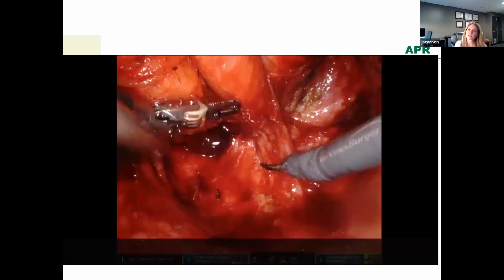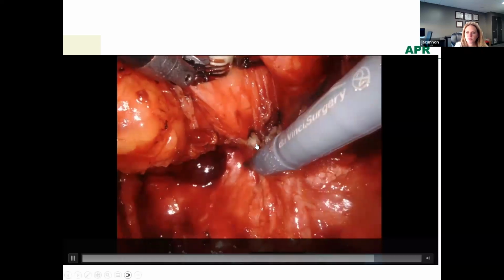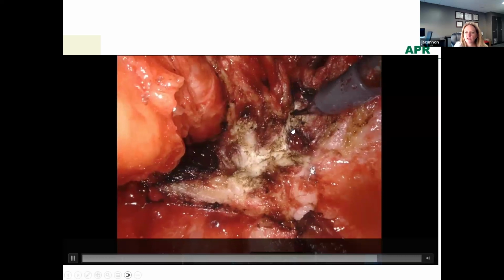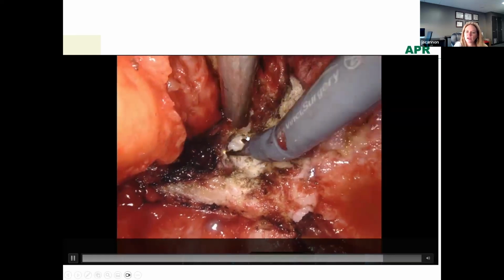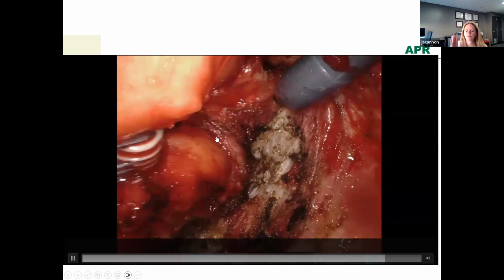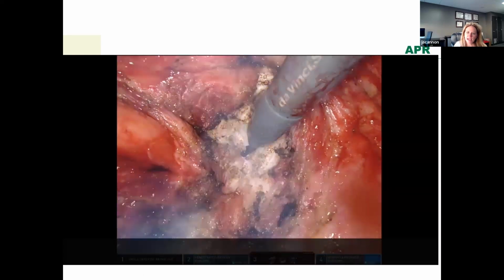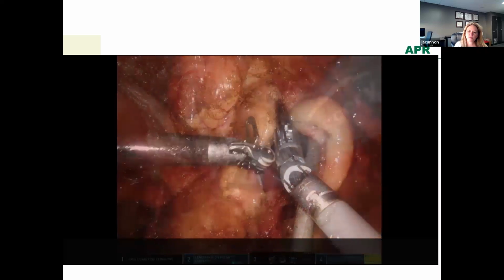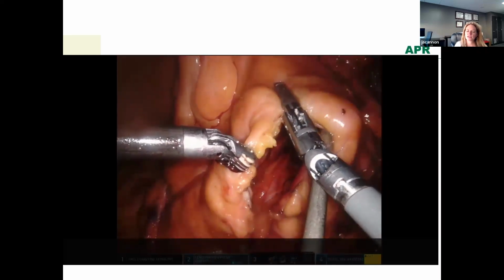Right there, you saw we just flipped the camera from 30 up to 30 down, which can really help show you these last posterior attachments. So here we're starting to get distal to the coccyx. We're dividing the anococcygeal ligament. We've already divided part of the levators, and we divide the anococcygeal ligament and connect essentially where we've divided the levators on the left and the right. And here we're on the right side, again dividing the levators on the right. In patients with favorable anatomy, you can often get all the way through the levators and down into your ischiorectal fossa and into that fat.